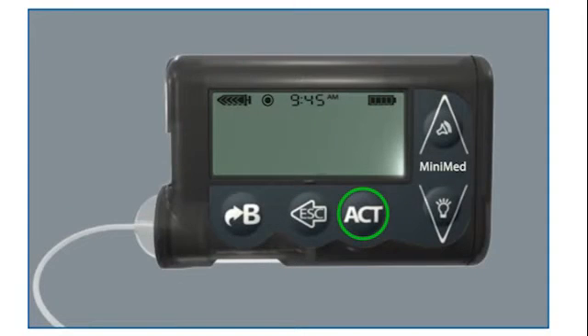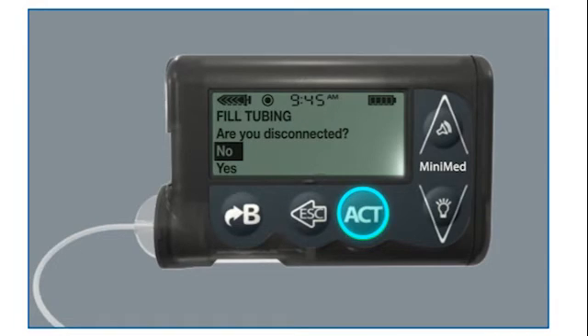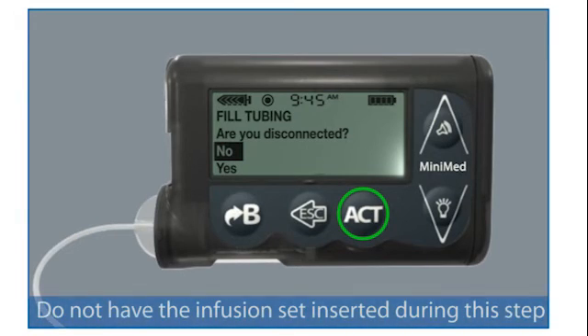To begin filling the tubing, press ACT. The Rewind Complete screen appears with instructions to place and lock the reservoir into your pump. Since you have already placed and locked the reservoir into your pump, you can now press ACT. The fill tubing screen appears asking if you are disconnected. Make sure the infusion set is not connected to your body. Press the down arrow to choose yes and then press ACT.